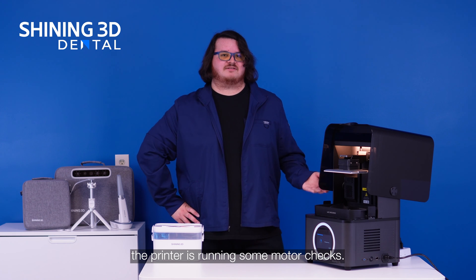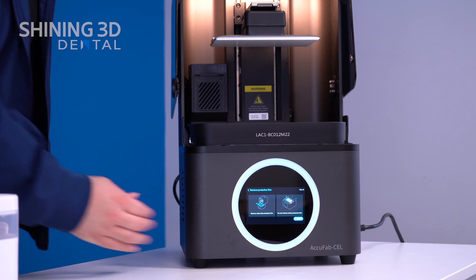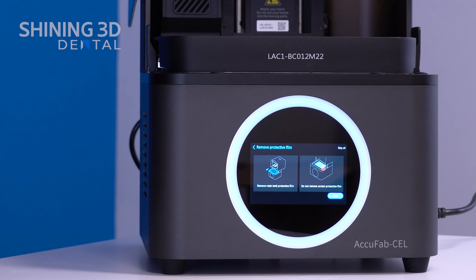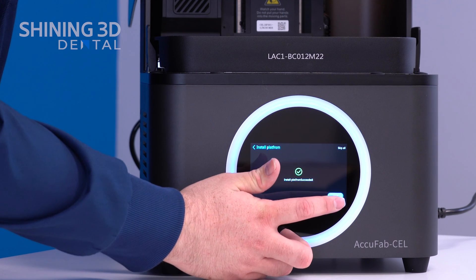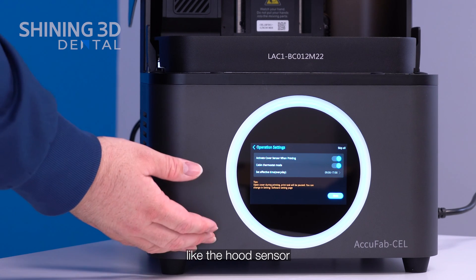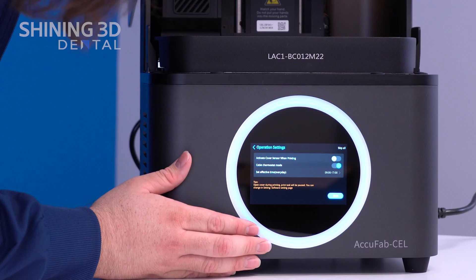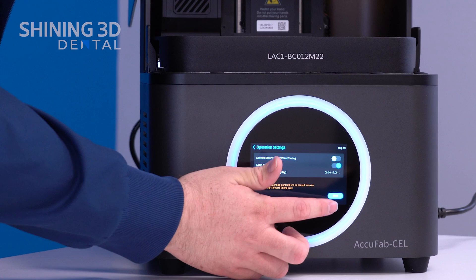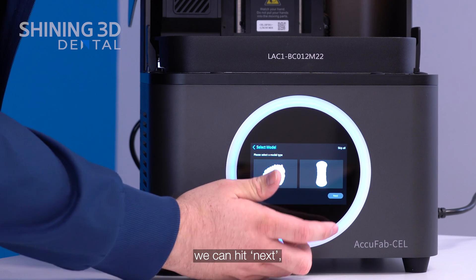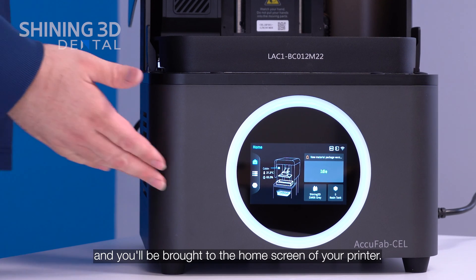At this point the printer is running some motor checks. Now we can remove the packaging from inside of the printer. Once removed, we can finish up the tutorial guide. There are some settings that we can toggle on and off, like the hood sensor and the temperature sensor for the cabin. After all settings are set, we can hit next to print some samples, or you can skip the sample printing step and you will be brought to the home screen of your printer.